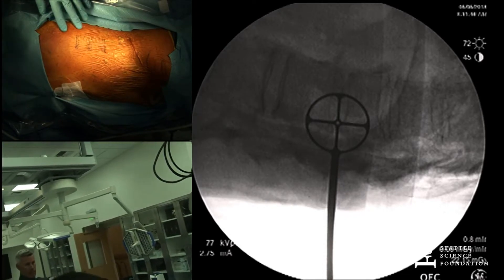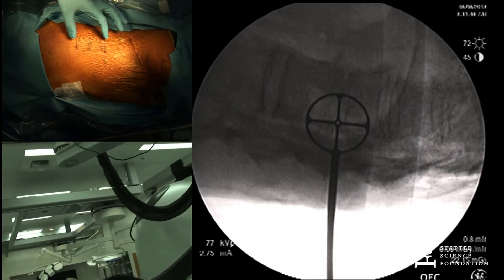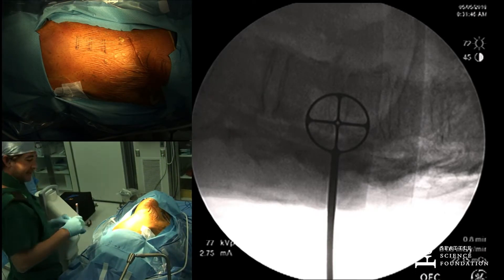So what level are you accessing right now? I think this is about T7 to T9, and we marked the disc spaces just so you guys can see.